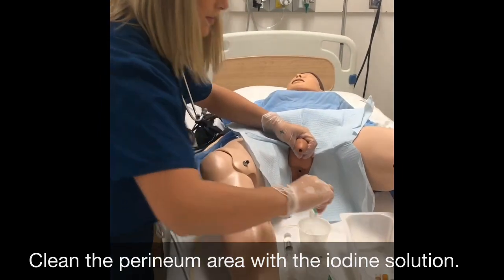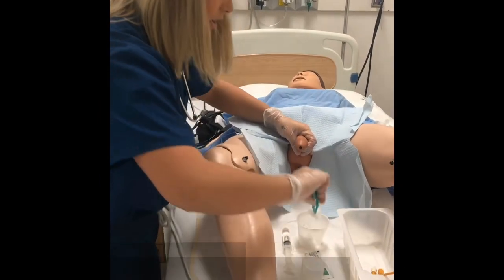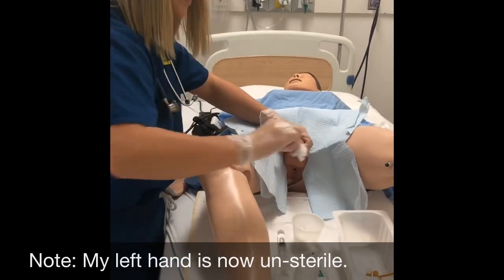Remember what's on there? Yeah. So it's like 3 fingers? 2, I don't remember how to do it, but and 3.